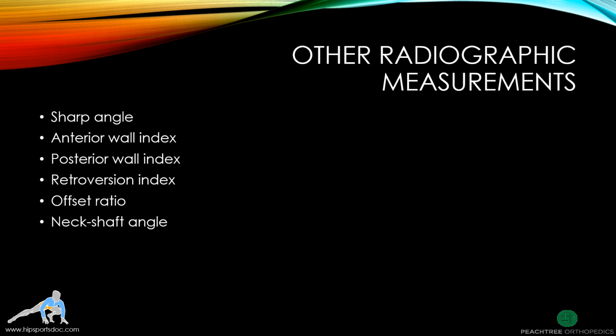These are other radiographic measurements that have been reported for hip preservation surgery but are not routinely used in most practices for diagnosis or surgical planning.